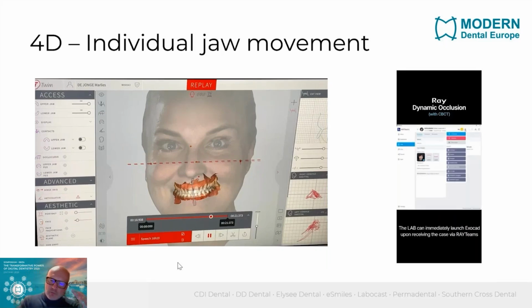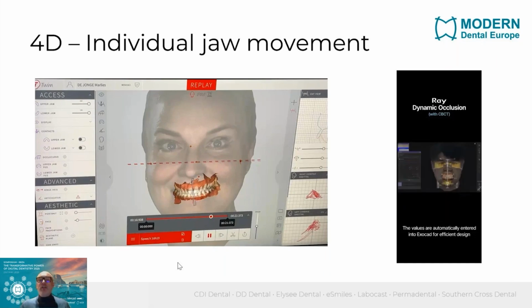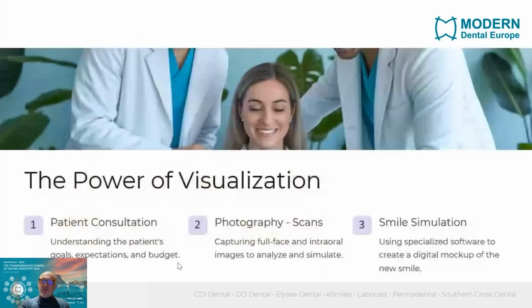So these are all new technologies which take it one step further than the average value articulator. This is really individual, patient-centered treatment and smile design.